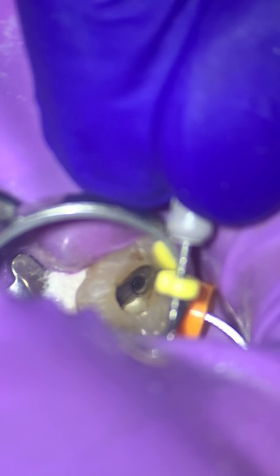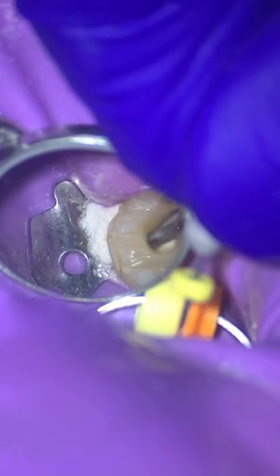hard to see it. So here what we can do is we're going to double check this a few times in the next part of the procedure, but I'm using a bent file with my rubber stop. The unidirectional indicator is directed towards a curve, and I'm using the tip of that file to feel around to see if I can get into another orifice. That's all I'm doing here, because perhaps that orifice is below where I can see. So we'll use our other method of figuring things out, our tactile sense.